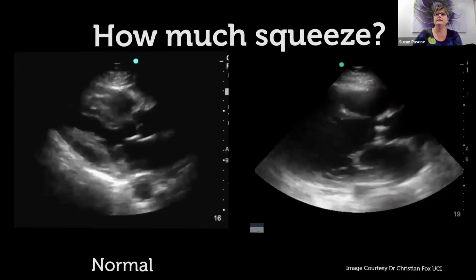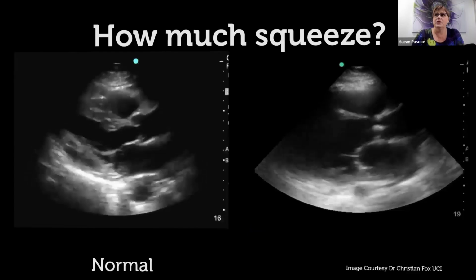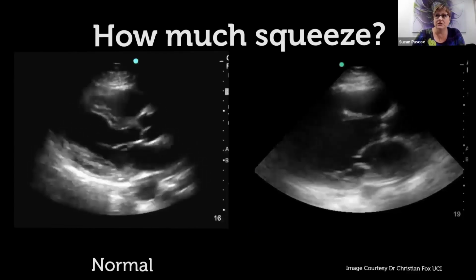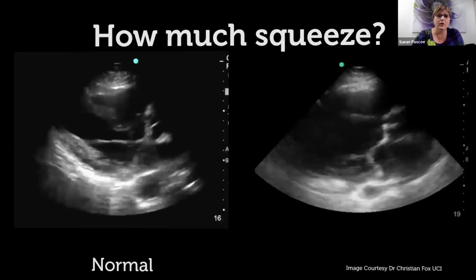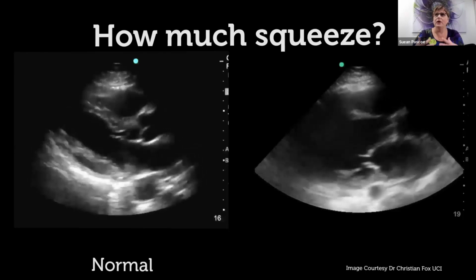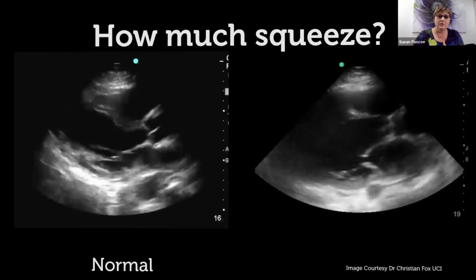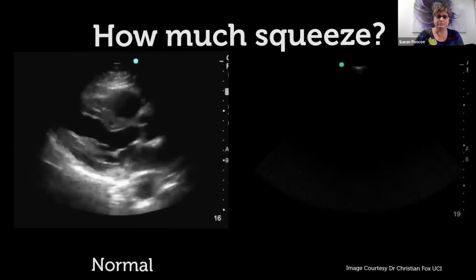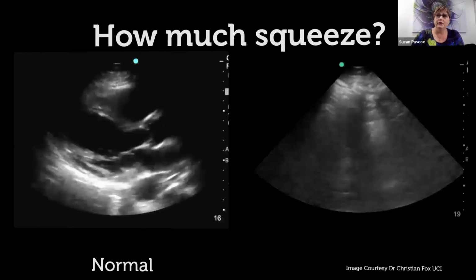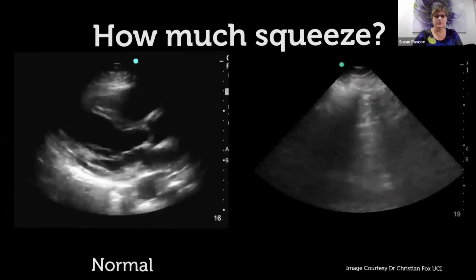And again, once it's severely abnormal, you can see that there's not so much squeeze in this heart. Now, intuitively, as you look at the picture, you can see that heart doesn't look so well. But can you classify what's actually going wrong? So if we're looking at the size of the left ventricle, the size of those chambers, we're looking at the rule of thirds there, and then look at the anterior leaflet of the mitral valve. It's not moving so nicely either. And then there's not so much squeeze.